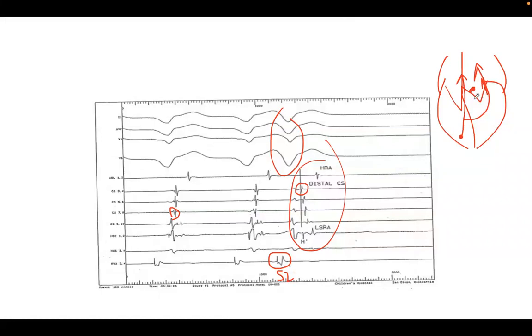Now you gave an earlier premature beat. Your AV node decrements or even blocks, such that now you have pure left atrial activation. And now this is the site where your map would be much more accurate, because now you're not having competition from the AV node, you're not fusing, you're not having retrograde atrial fusion, you're having pure retrograde from the accessory pathway.